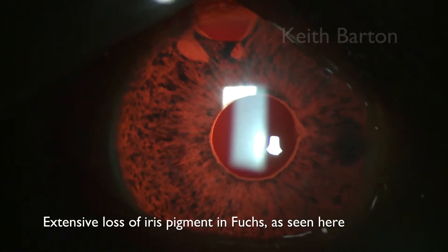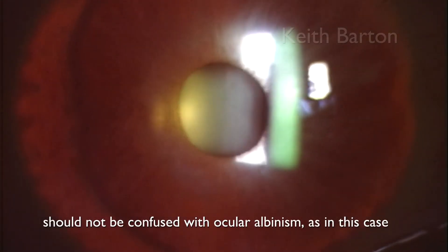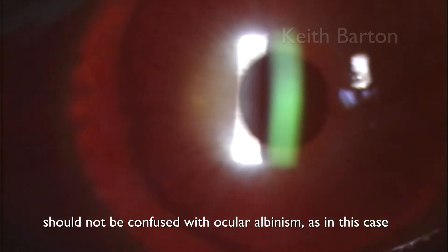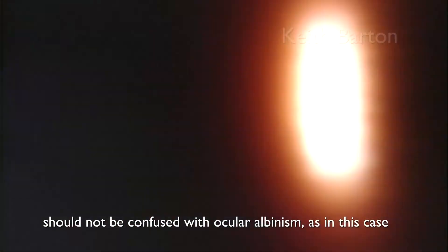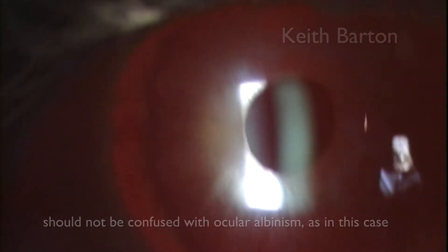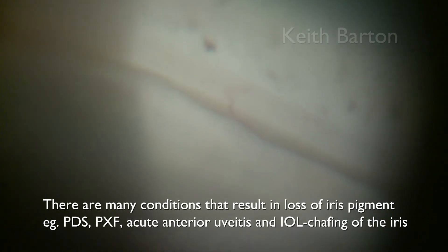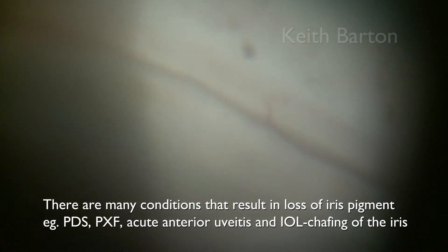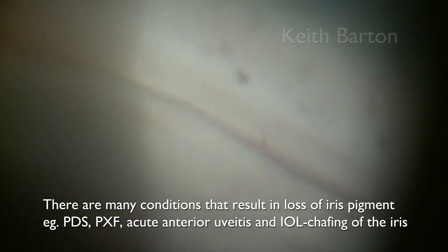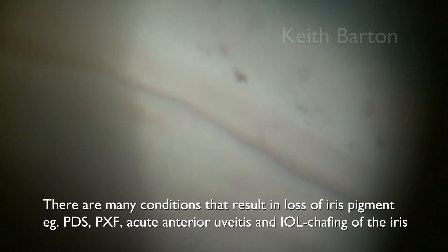Extensive loss of iris pigment in Fuchs, as seen here, should not be confused with ocular albinism, as seen in this case. There are many conditions that result in loss of iris pigment, such as PDS, PXF, acute anterior uveitis, and also IOL chafing the iris.